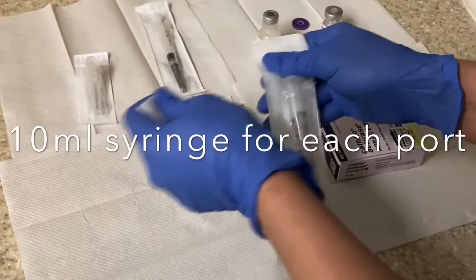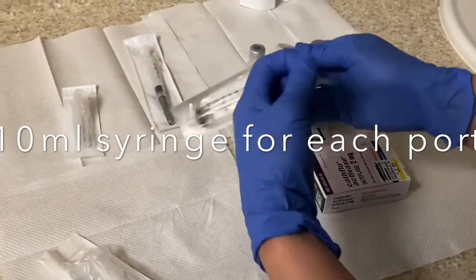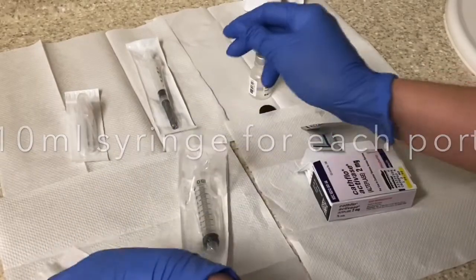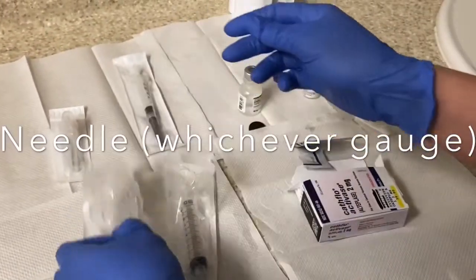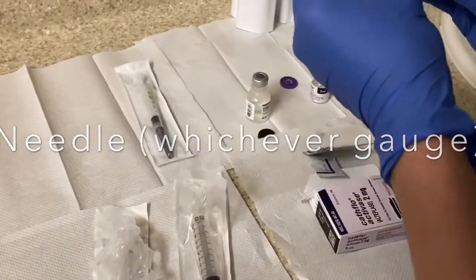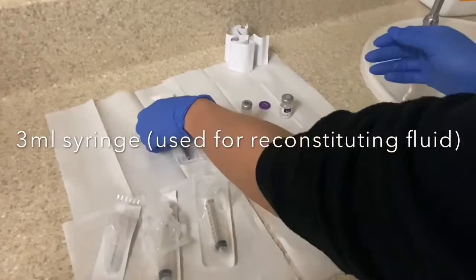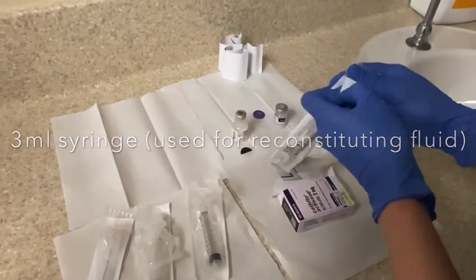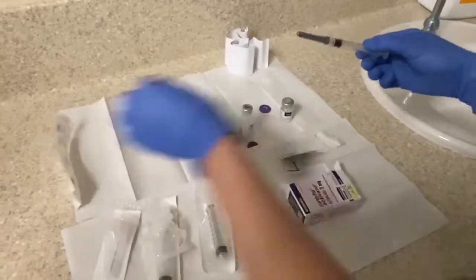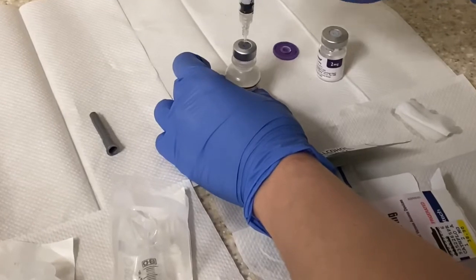Over here we have 10 ml syringes, one for each port. We also have a needle — the gauge doesn't matter — it's just for transferring the finished product to the 10 cc syringe, and then a 3 ml syringe for reconstituting the fluid itself. We use a smaller syringe because it's easier to get the accuracy correct.